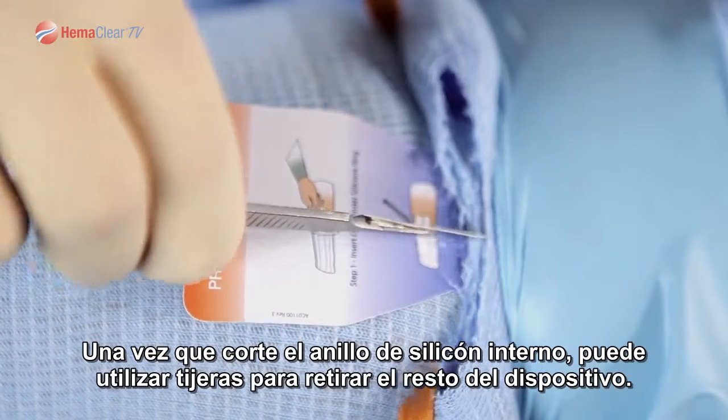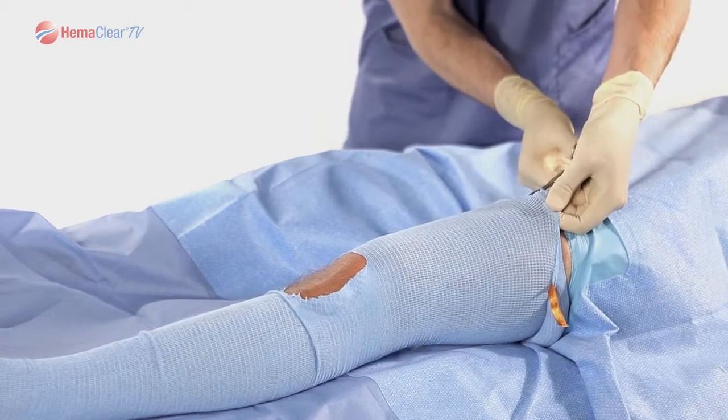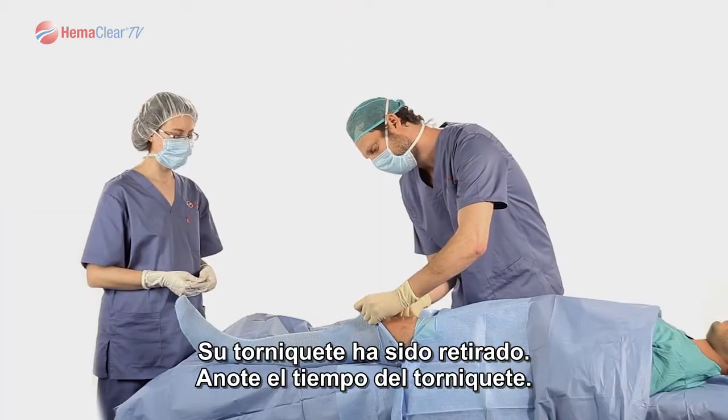Once you are through the internal silicone ring, you can utilize scissors to remove the rest of the device. Your tourniquet is now down. Note the tourniquet time.